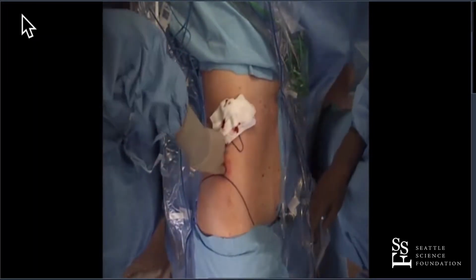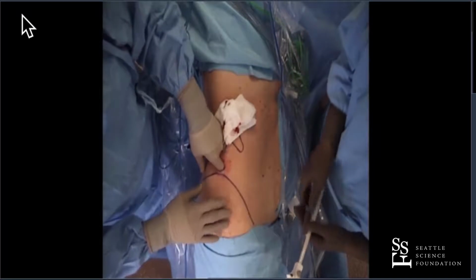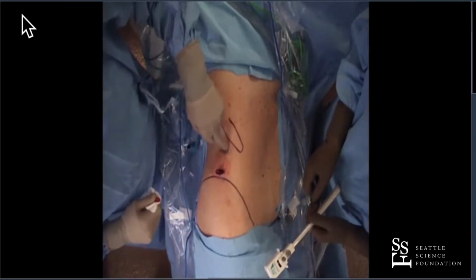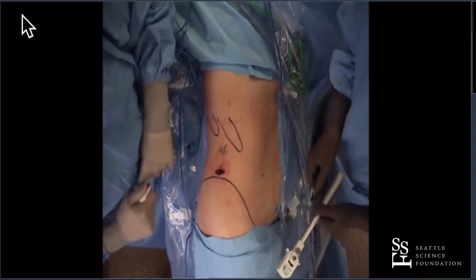So as you just pointed out, Ronnie, I made an incision right above the iliac crest. And I think the key about this incision is that, especially on the right side, where the kidney's lower, a lot of people talk about using the 12th rib and the 11th rib and moving up here. The problem is, then you're right on top of the kidney and your robotic arms are straight up and down, and it's just not as good an angle.